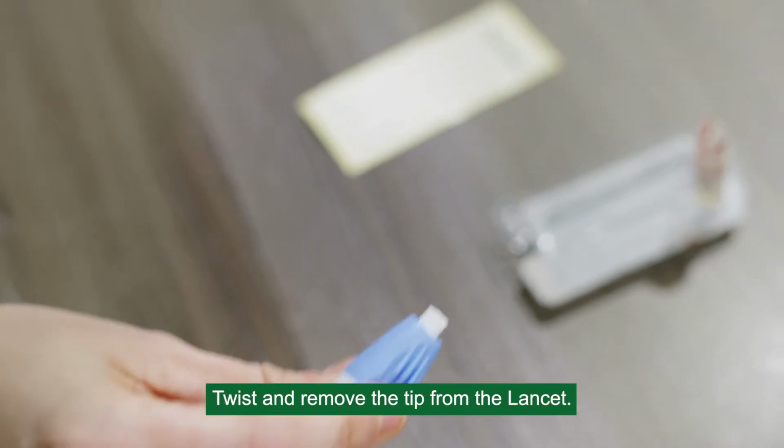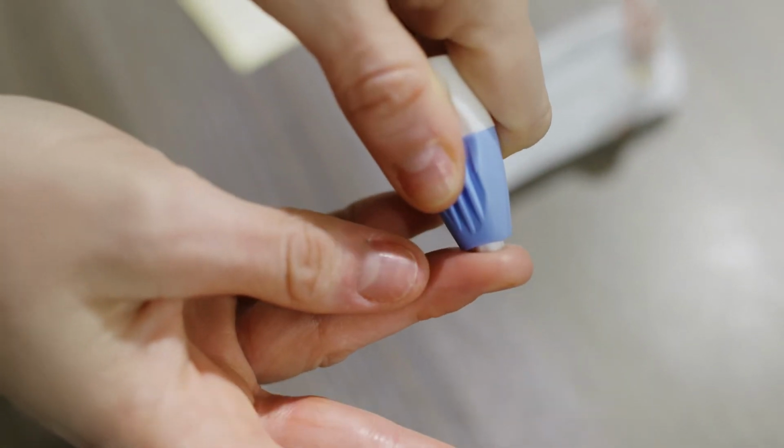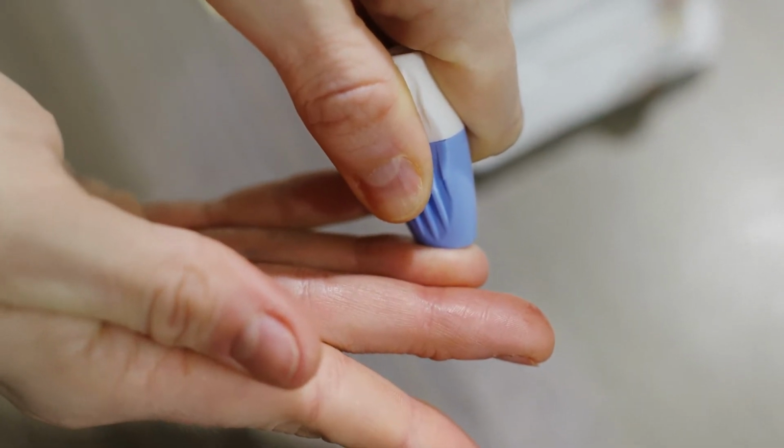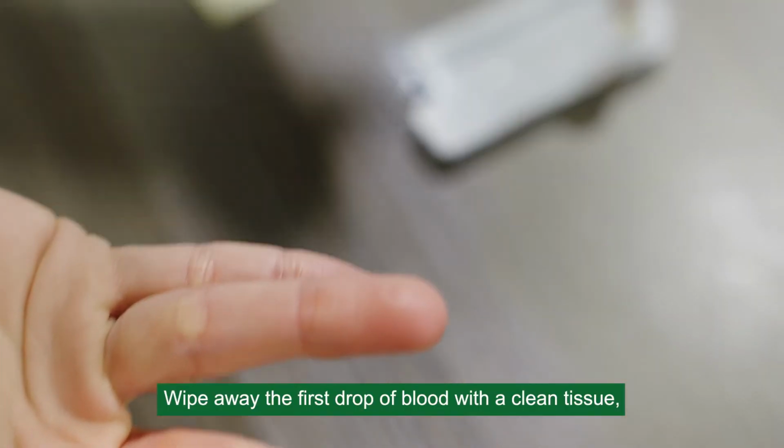Twist and remove the tip from the lancet. Press the lancet firmly against the tip of your finger. You will feel a small prick and a small drop of blood will form. Wipe away the first drop of blood with a clean tissue.